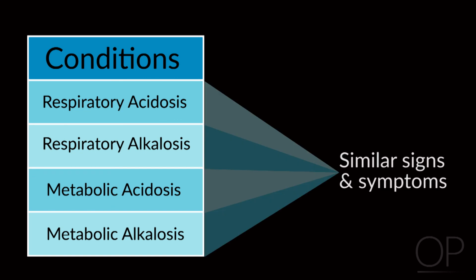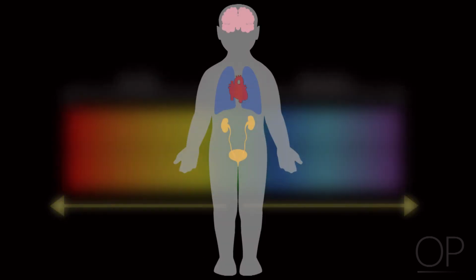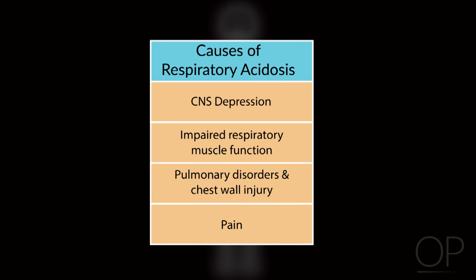As mentioned in the introduction to this presentation, our body's normal and basic functions and cellular metabolism is very sensitive to acid-base imbalance. If blood pH is abnormal in one direction or the other, the normal body system processes will begin to fail, and that failure will manifest into these abnormal signs and symptoms.